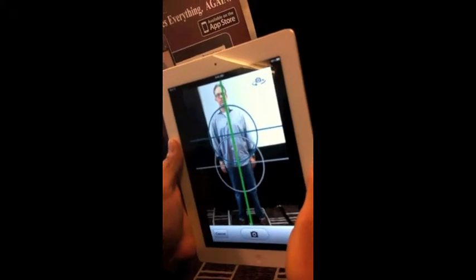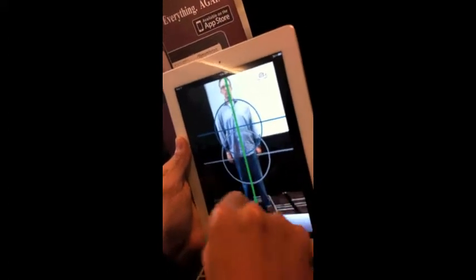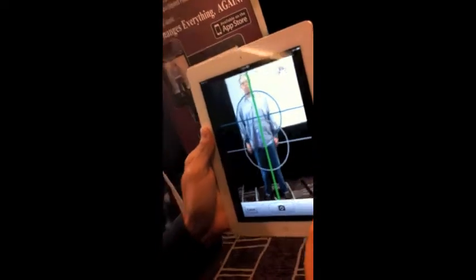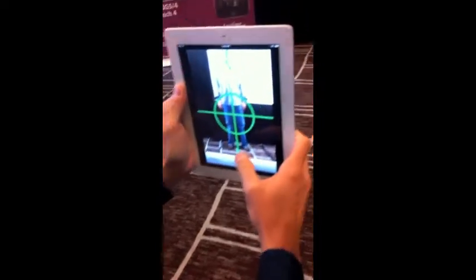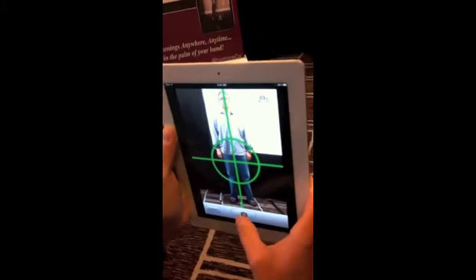To do this the right way, you want to get on a knee so that this line is mid-pelvis. So what I mean by that is, I'm going to get down on my knee, come down like this, and can you see that I would snap my picture just like that.